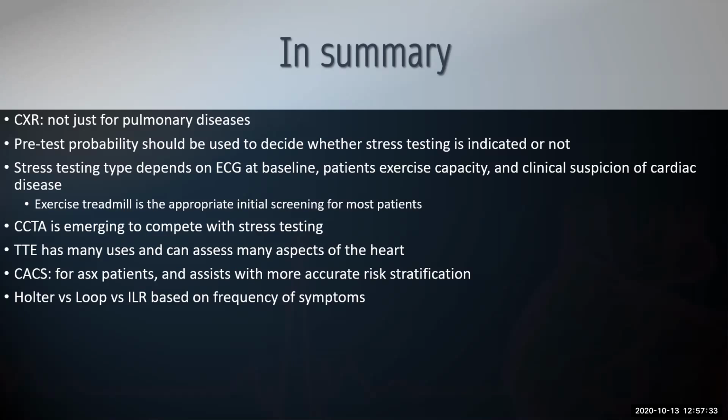And then we finished with Holter monitors and implantable loop recorders based on the frequency of symptoms, deciding which one to do in our workup for cryptogenic strokes, atrial fibrillation, palpitations, PACs, PVCs, etc. That is it. And that's the first time I've completed, well, it was half of a lecture though, on time.